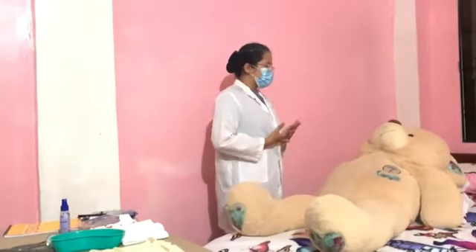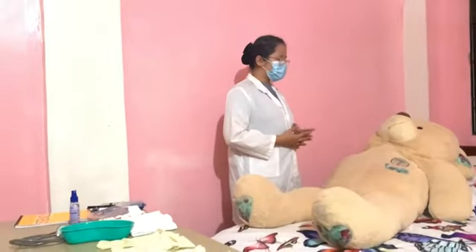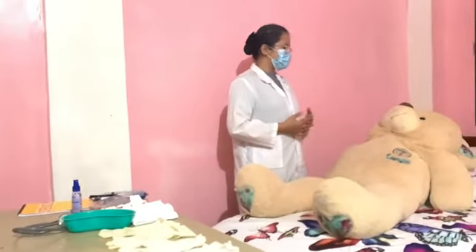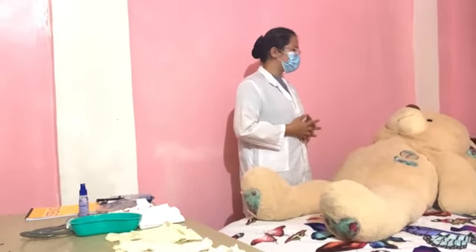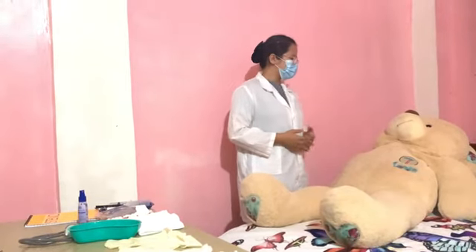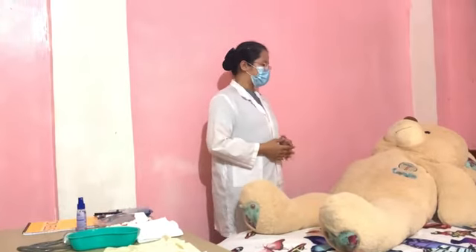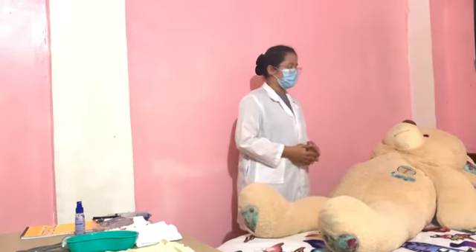So, today ulit ma'am, today po, mag-i-insert po ako ng NG tube sa inyo since hindi po kayo naka-swallow. So, this procedure may hurt you or may give you uncomfortable feelings since this is an invasive procedure. Pero rest assured po ma'am na hindi naman po serious yung pain. And then if you have any clarifications and questions, don't hesitate po to ask me.